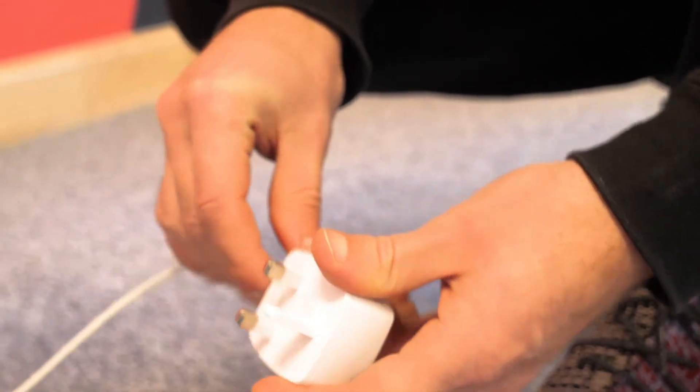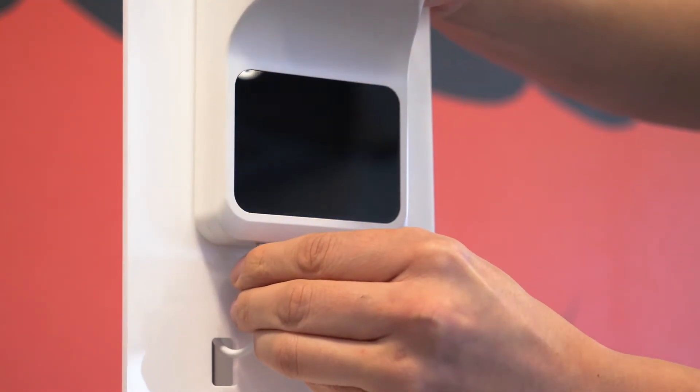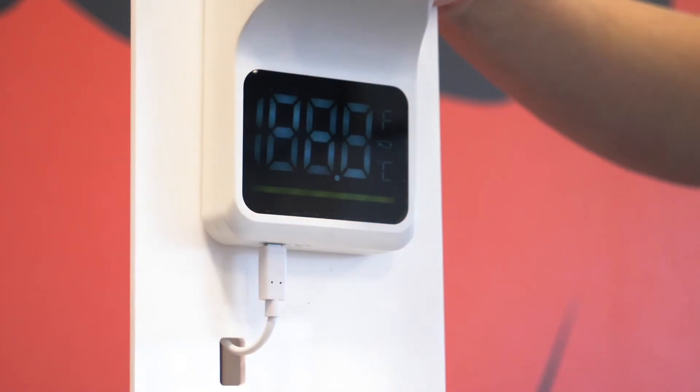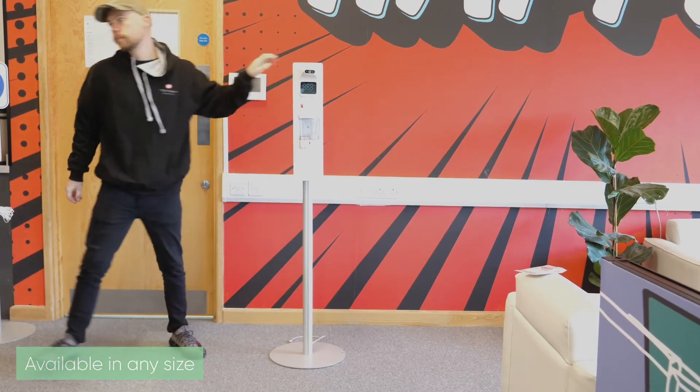If you need to charge your unit, simply plug it into the wall and insert the cable into the underside of the thermometer. The product also has a handy shelf which is great for masks.